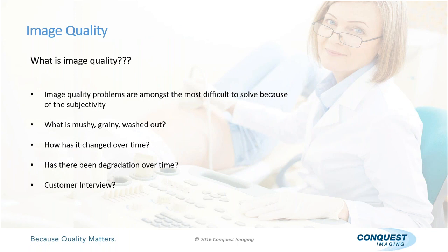Image quality, well, that's kind of a tough one to define because it really is somewhat subjective when you're talking ultrasound. You talk to the sonographer and they use terms that are mushy, grainy, washed out, and those are highly technical terms when you think about it, because what do they mean? What does mushy mean to one sonographer as opposed to another? And that's hard for us to understand because we don't spend every day scanning different patients. How has their image changed when they're describing this as mushy or grainy?